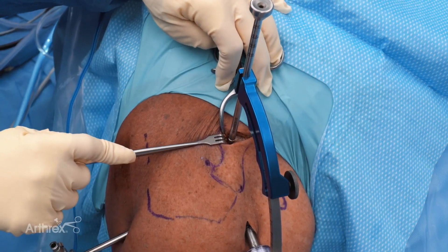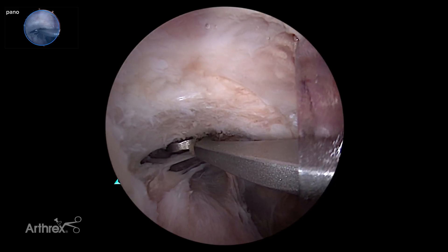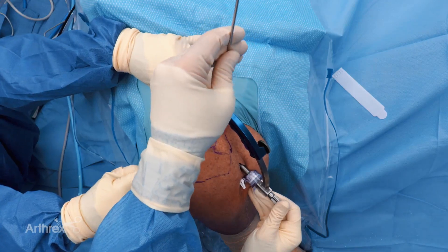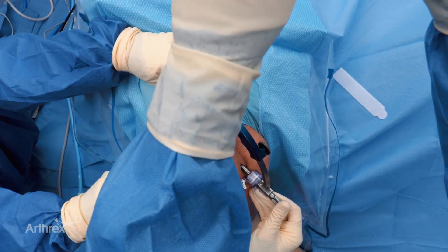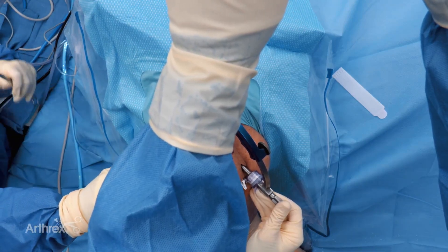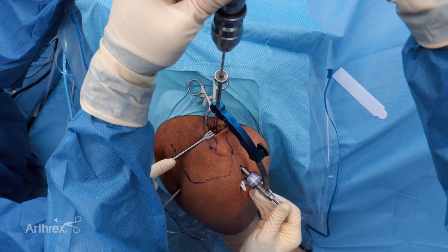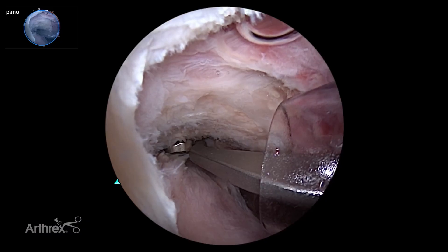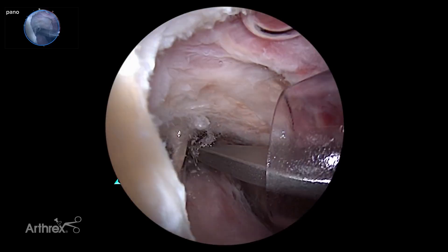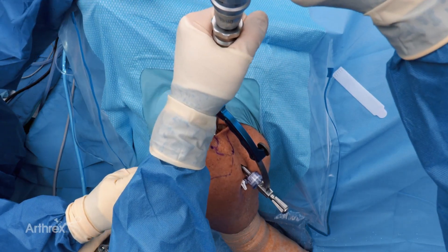We're center-center on the clavicle. We've got our guide under the coracoid where it needs to exit, close to its base, and we're going to go ahead and drill. With this cannulated drill you should be able to feel four cortices: the first cortex is the clavicle, the second cortex is the base of the clavicle, and then you'll feel the drill bit drop to the coracoid — through the coracoid — and we'll see the drill bit come through in our arthroscopic view. You want to have good control so you don't dive, and once you get it in, you can uncheck it from the handpiece.